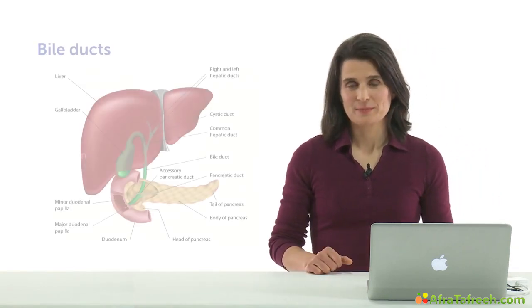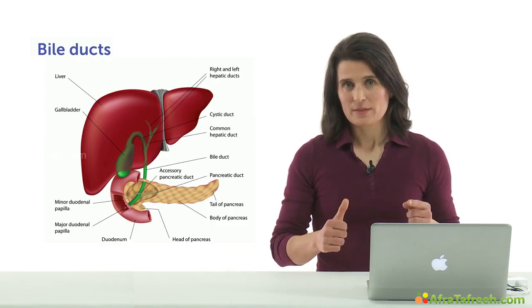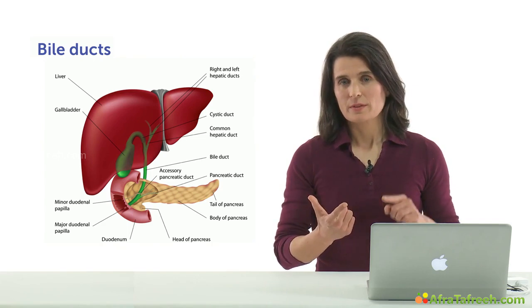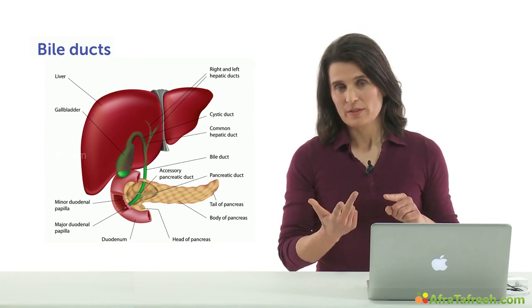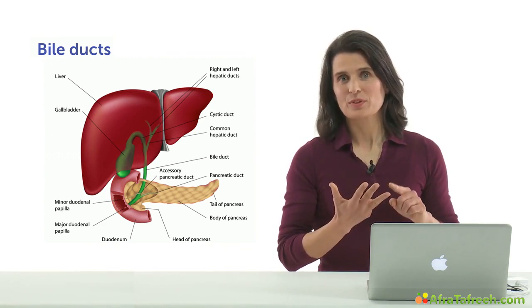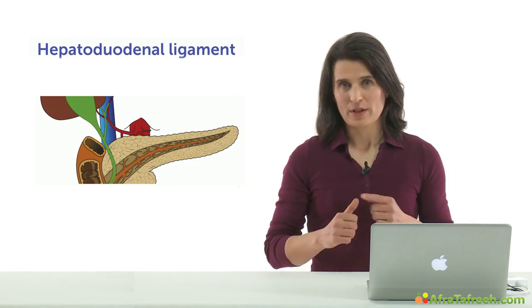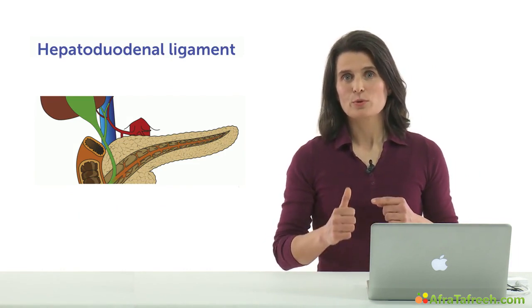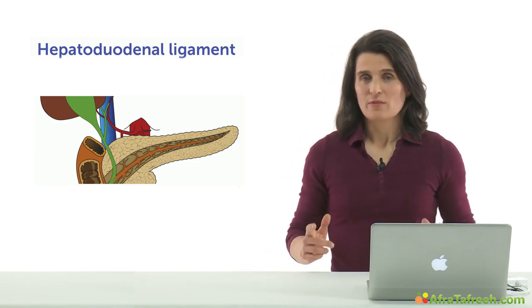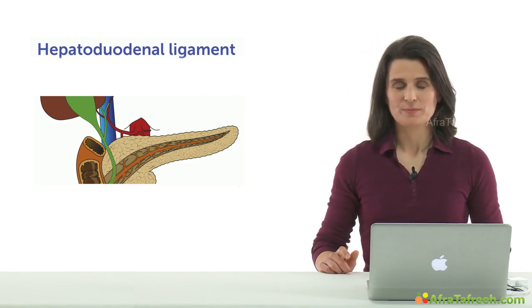Another vessel system we want to talk about are the bile ducts. In liver anatomy and physiology, the bile ducts, the hepatic artery, and the portal vein and its branches always go together, from the start in the portal triad to the liver hilum. And they also run together in the hepatoduodenal ligament. This is a very important structure we have to evaluate in every ultrasound examination.